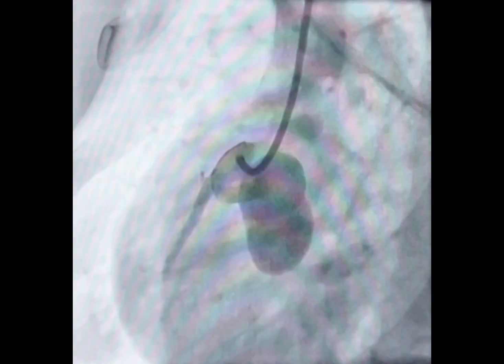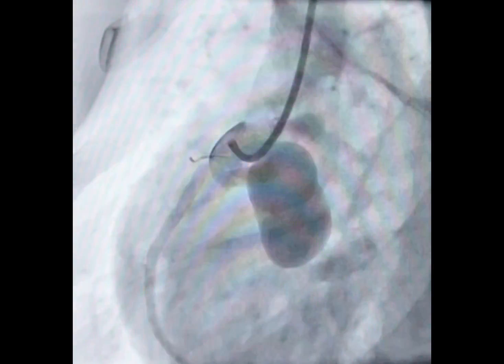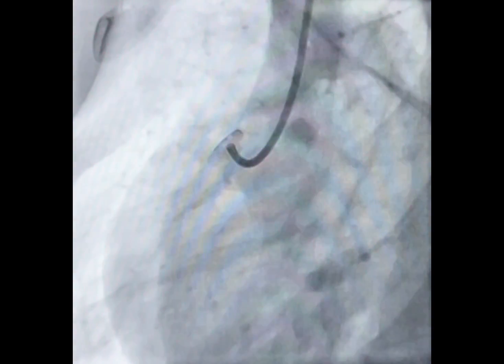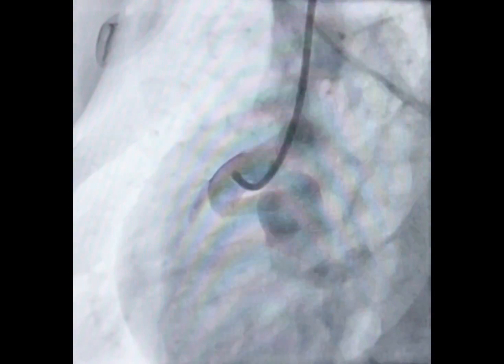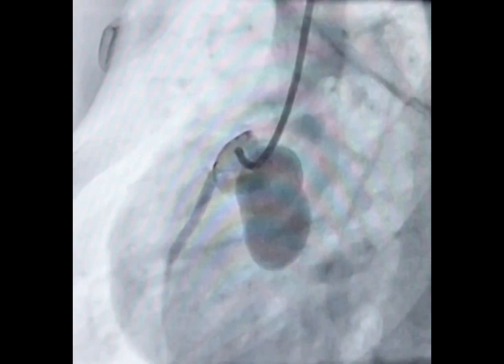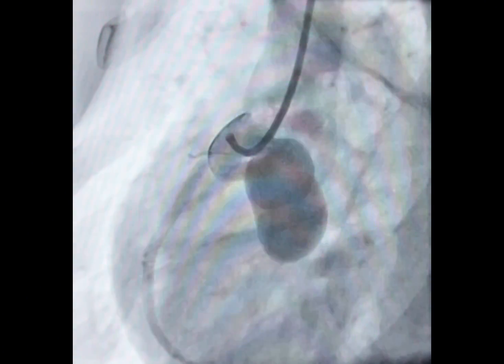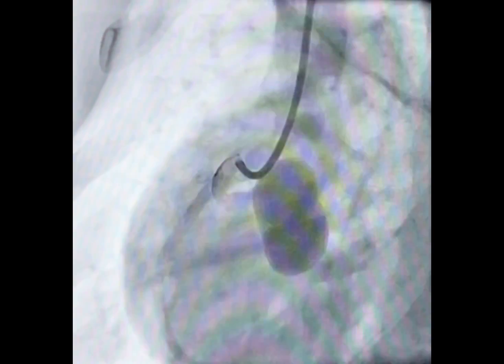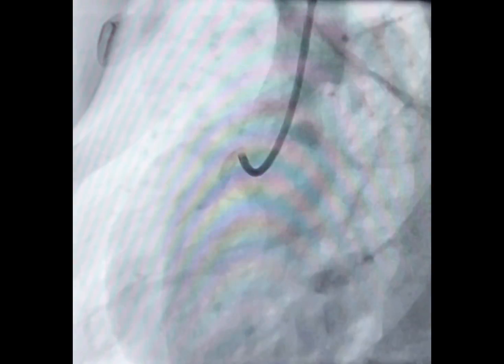The RCA is the most frequently involved artery, followed by the LAD. Typically, these fistulas drain into the right heart structures, such as the right atrium, right ventricle, or pulmonary artery.